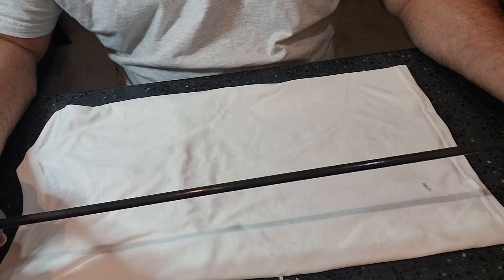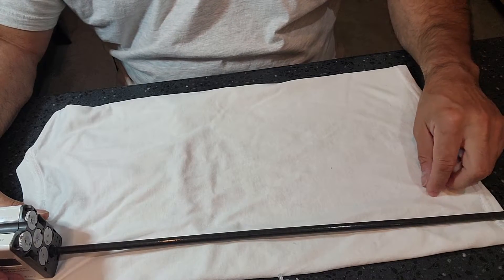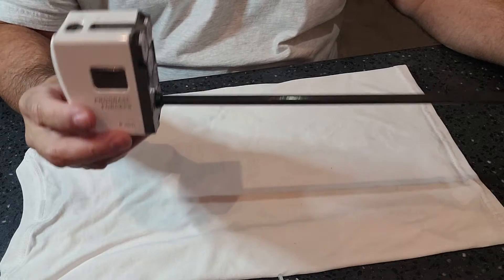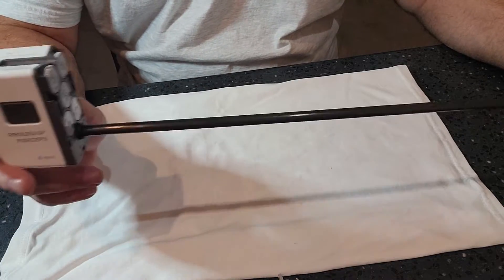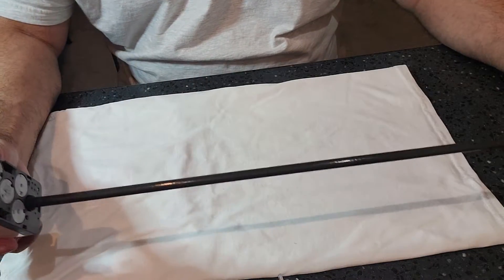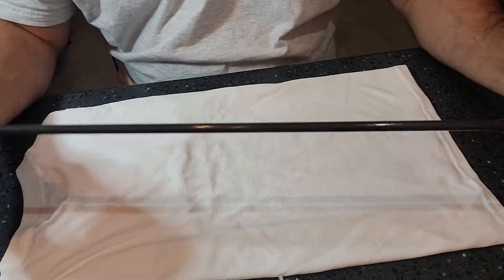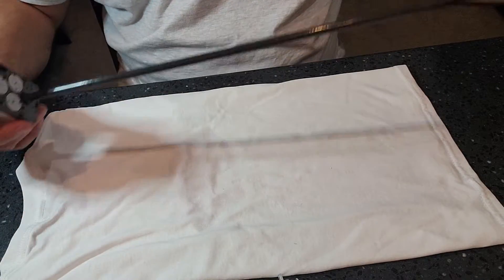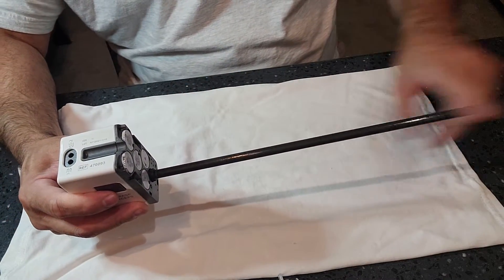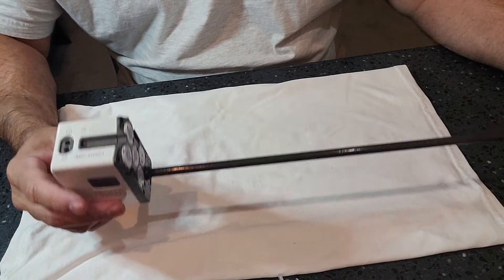You also have the option to place this through a washer disinfector, but only one validated washer disinfector is approved for these instruments. Check that IFU as well. If you're going to put it through the washer disinfector, just placing it as-is is not going to do this instrument any good. It doesn't fit in many washer disinfectors, so there are special racks with special attachments to allow flushing of the inside cannulation and good mechanical cleaning of this instrument.